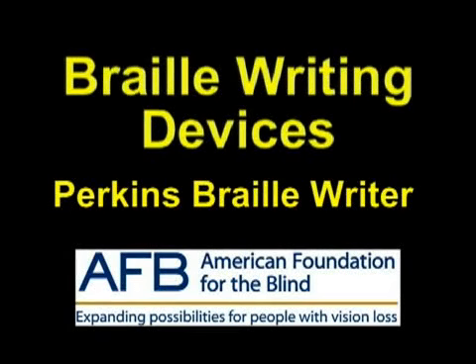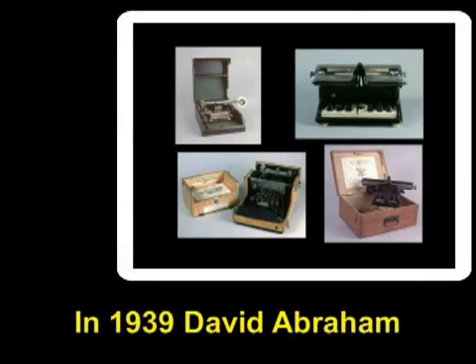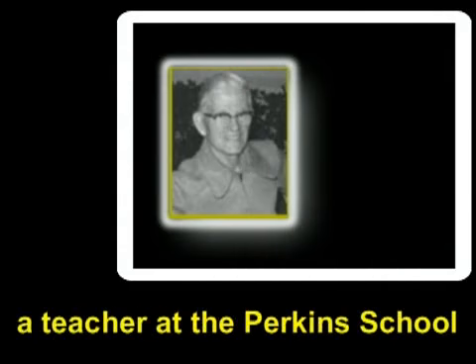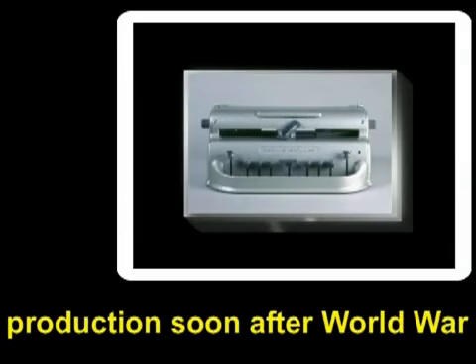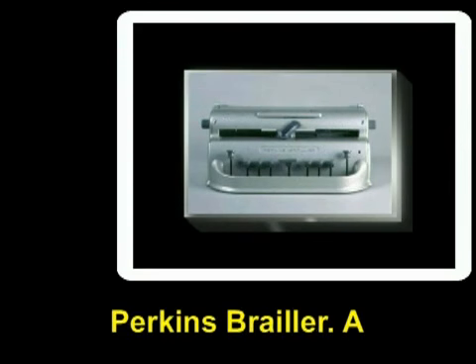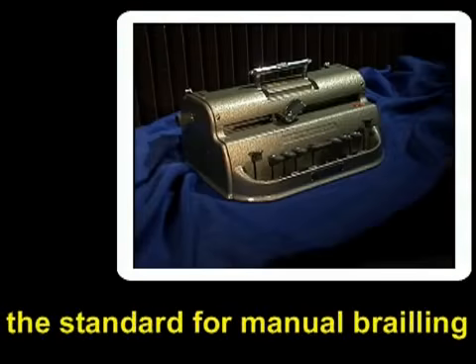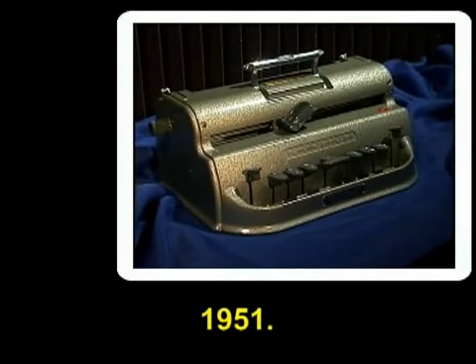Braille Writing Devices: the Perkins Braille Writer. Early Braille writers were expensive, noisy, and heavy, and needed frequent repair. In 1939, David Abraham, a teacher at the Perkins School for the Blind, designed an improved machine that went into production soon after World War II. The result was the Perkins Brailler, a Braille writing device that has set the standard for manual brailling throughout the world since 1951.